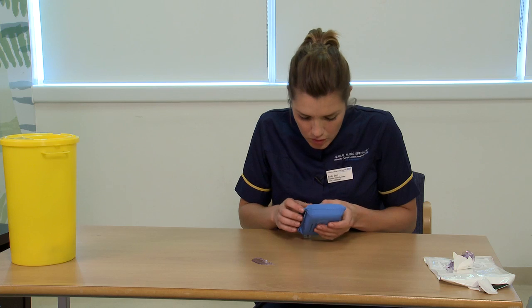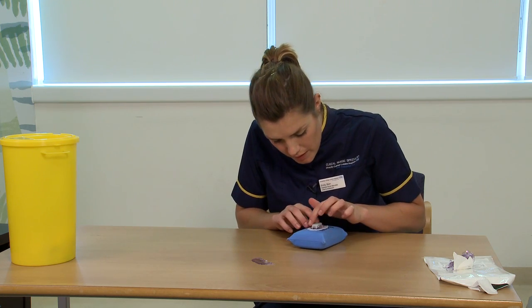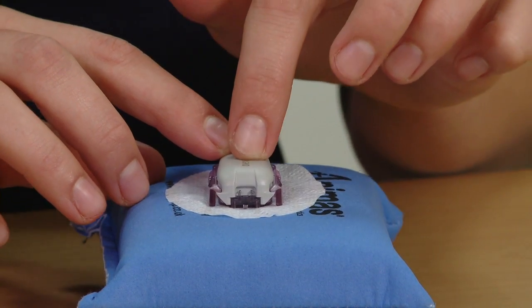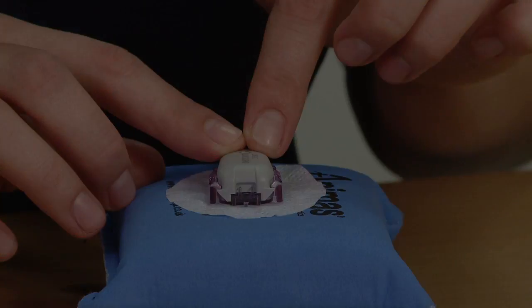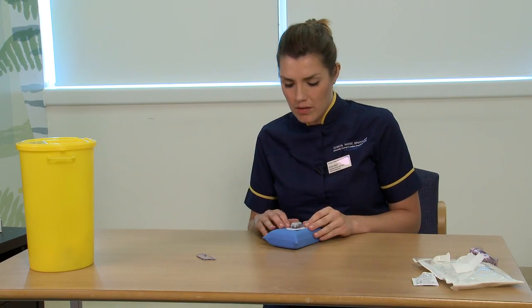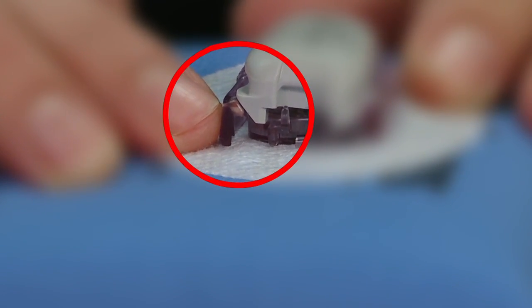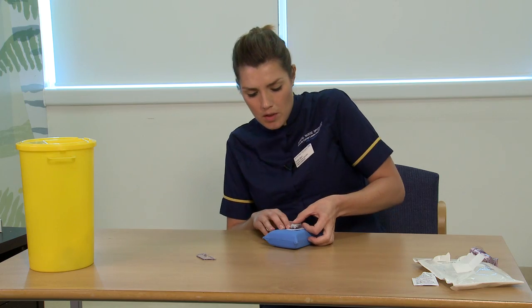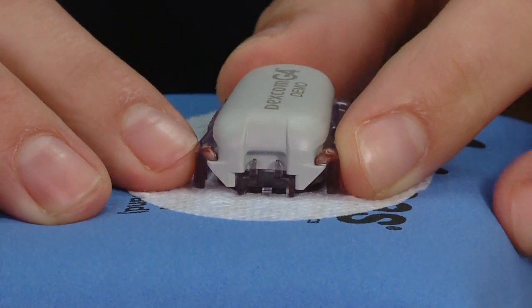Now ensure that the transmitter is in properly. As you can see, this transmitter has been properly inserted and is flush to the sensor. You may find that the transmitter doesn't sit well into the sensor casing — for example, where a corner is slightly raised up. All you need to do is press down firmly until it's all clipped into place.